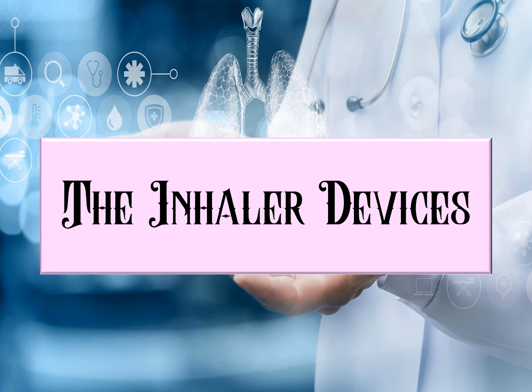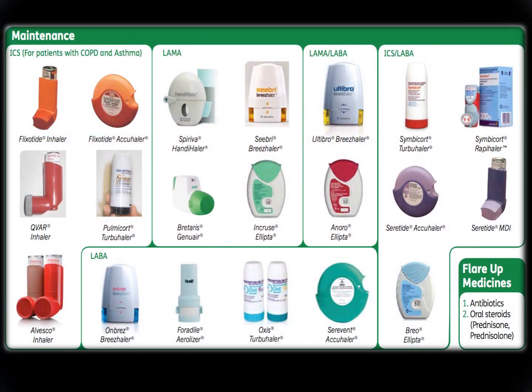Because if the patient is unable to use the inhaler properly, no matter how good the inhaler is in the first place, it will never work. So let's proceed. We have a lot of inhaler devices available in the market. We have MDIs, we have dry powder inhalers, and then we also have a soft mist inhaler. These are available in our country, except for some of them.